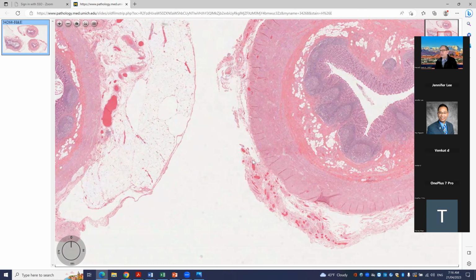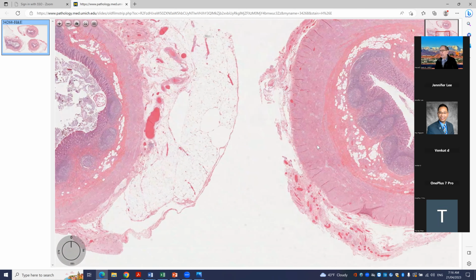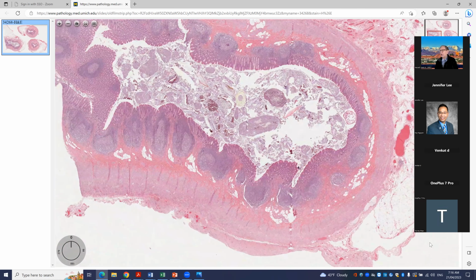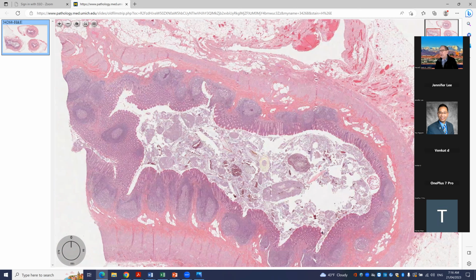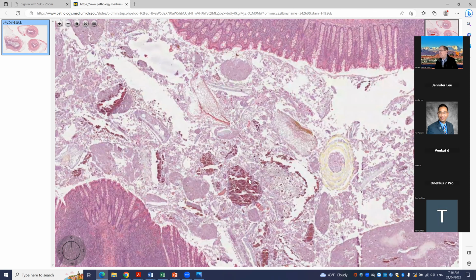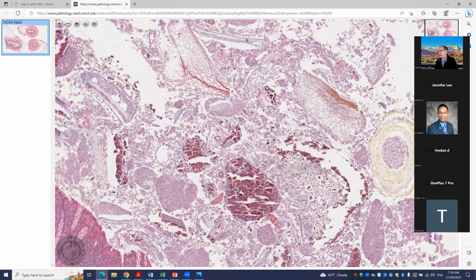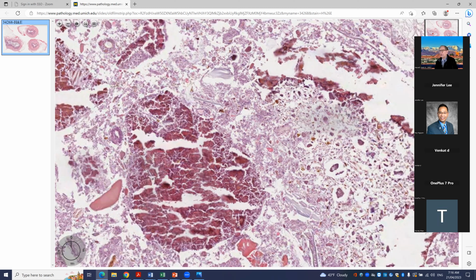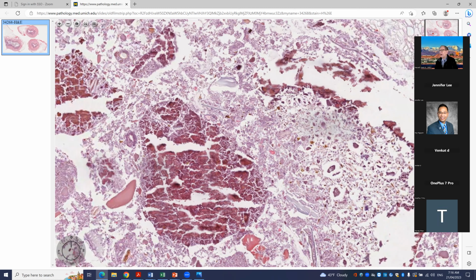You want to look in the distal tip for things like neoplasms and so forth. But I think it's also very worthwhile to remember to look at what's inside the lumen, see, you can get an idea of what maybe the patient was eating or other sorts of things. You might also get a few clues, things like this that look a little bit granular, or maybe little cystic structure-like things.